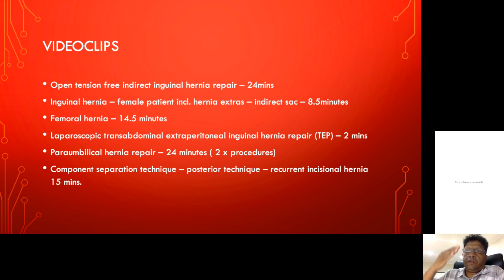Remember that the peritoneum is now coming down on the inside of the rectus muscle, and it then goes onto the pelvis and it curves. It's like a bowl sitting in the pelvis. So the incision that was made was to open up the rectus sheath, right? It was a transverse incision, but then the incision on the anterior aspect of the rectus sheath was vertical, almost in the middle of the right rectus sheath. And then the rectus muscle was retracted to the right.